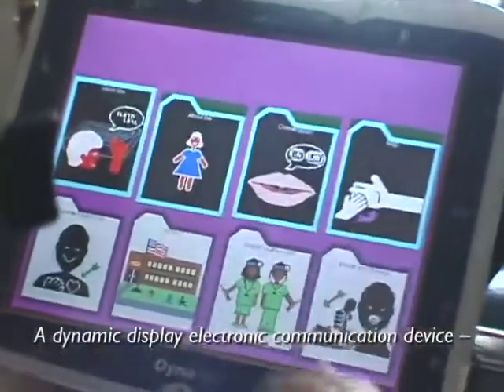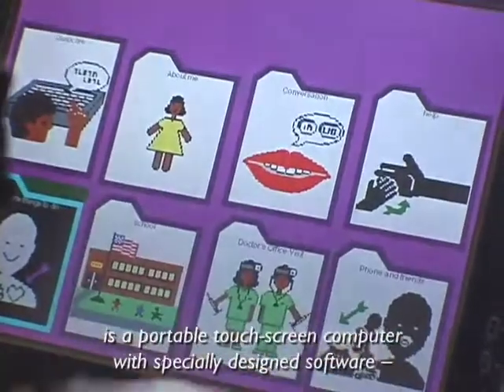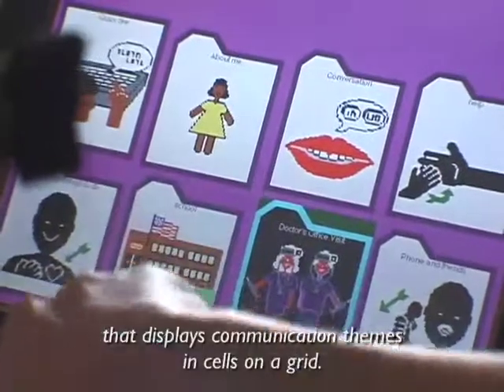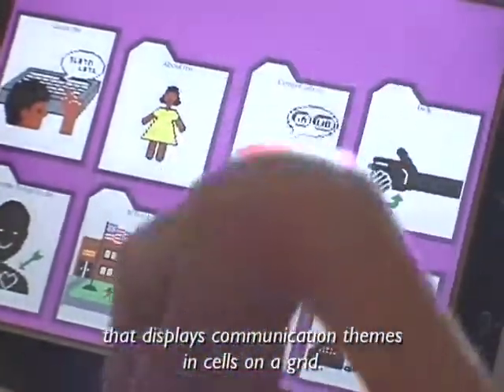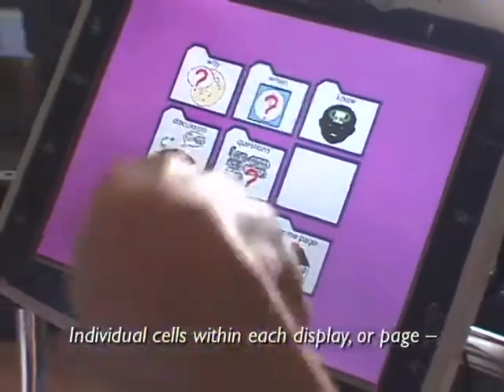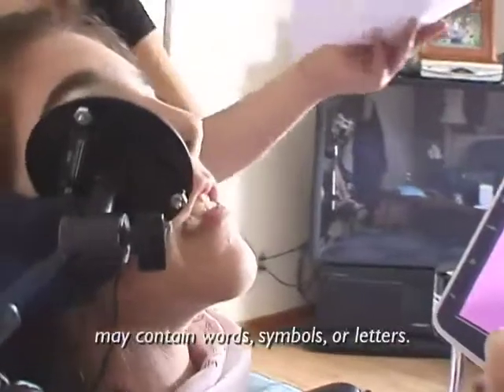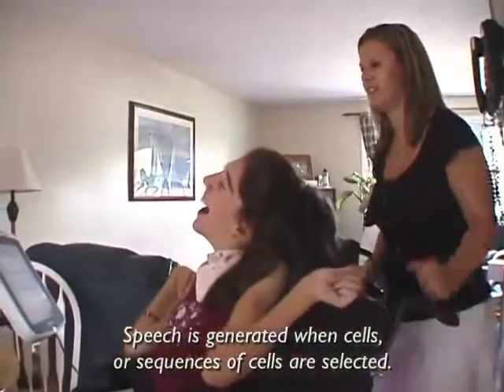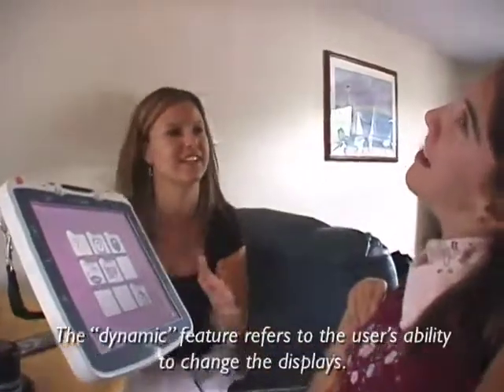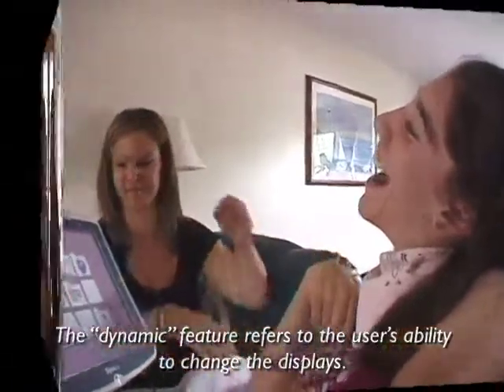A dynamic display electronic communication device is a portable touchscreen computer with specially designed software that displays communication themes in cells on a grid. Individual cells within each display or page may contain words, symbols, or letters. Speech is generated when cells or sequences of cells are selected. The dynamic feature refers to the user's ability to change the displays.